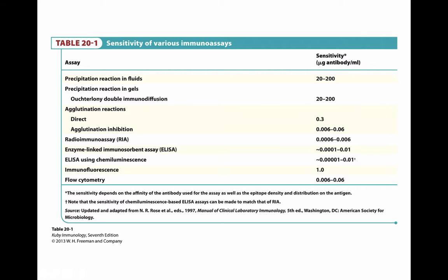You can run a 96-well plate and probably get 80 to 85 samples on a plate and run each one in duplicate. So technically, you could probably get 40 different samples on a single plate. So if they're testing blood samples for lupus, or they're checking blood samples for Lyme disease, they can send the reference sample off to a lab that runs this type of assay, and they can run a bunch of them at one time. So a plate that costs $500 to run, you're getting 40 tests out of it. So it really is pretty efficient.